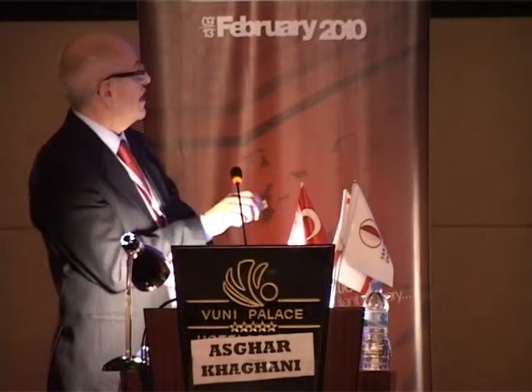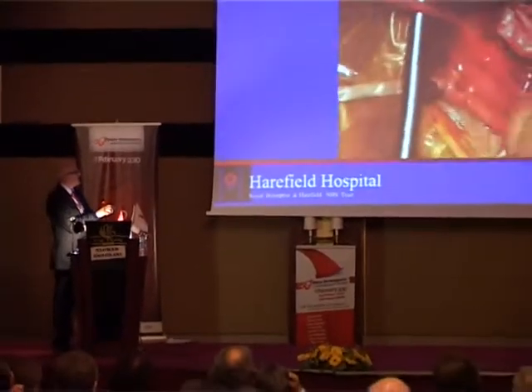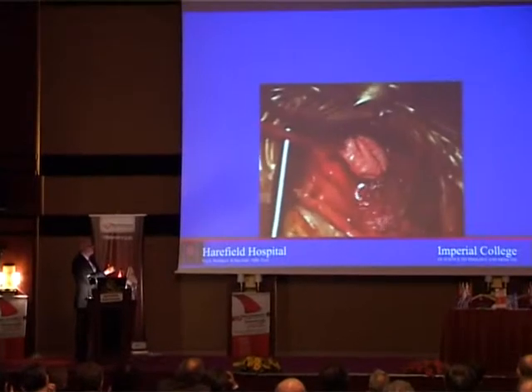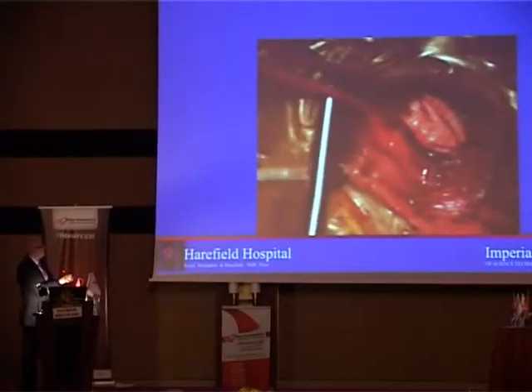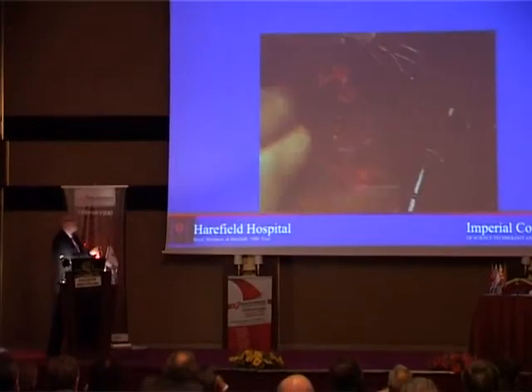This is now the ascending part. We have identified this exact area with the CT reconstruction, and we mobilize the outflow. And then sometimes we actually use this to go on cardiopulmonary bypass. So tie that part off and cannulate that, because the heart is already recovered.